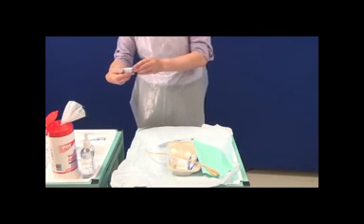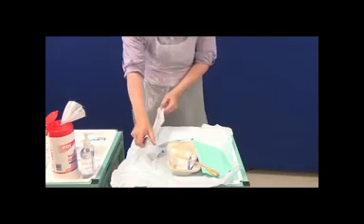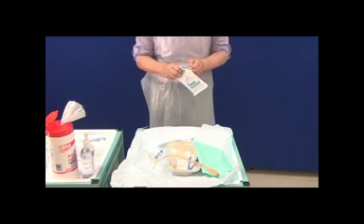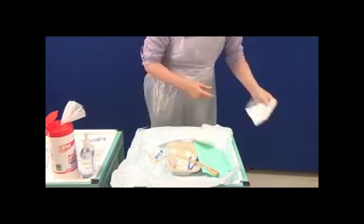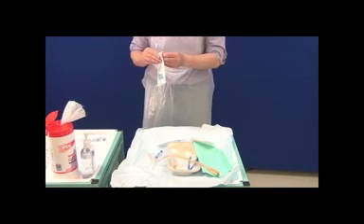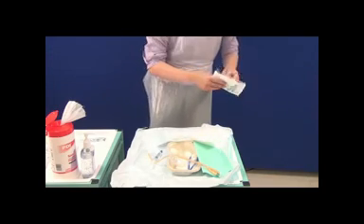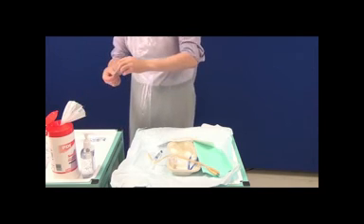Check the expiry date on your instillagel, and again carefully open it into the sterile field. Check the expiry date on the sterile gloves and put those into the sterile field, taking care not to touch them. It should be noted that two pairs of sterile gloves are usually required to perform this procedure, although this will vary from site to site.